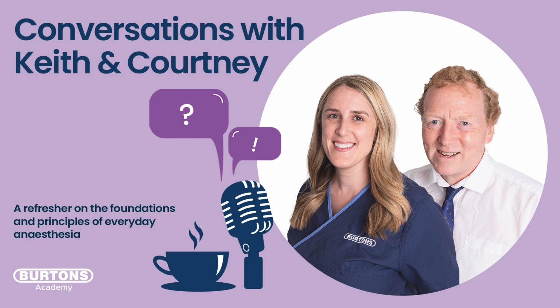And you should see that your 53 becomes 48, 47, 46, 46, and it stops at 46. Well, okay, you haven't quite done it enough, have you? You either increase the respiratory rate again slightly, or if you feel you're at the limit of the respiratory rate, then you need to look at the tidal volume.